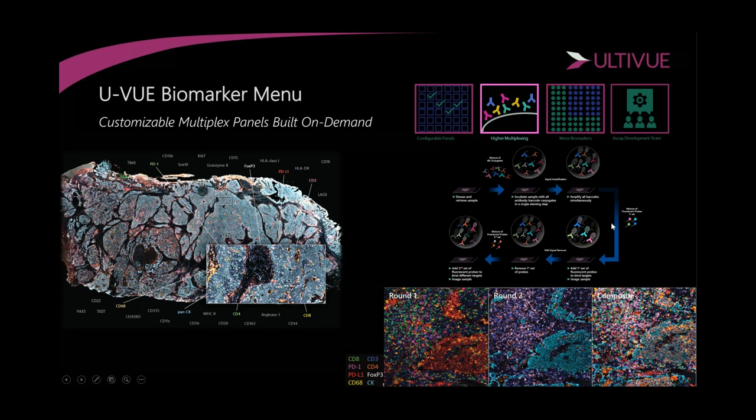Now, this is where the workflow has an addition. We add in a mixture of probes for antibodies 1 through 4. We image that on the slide scanner, and that's where you're getting this round one of imaging. Now, we use a process called DNA exchange, which is a gentle dehybridization process that removes the complementary probes from their DNA barcodes. So now if you were to image that again, you would get no signal.